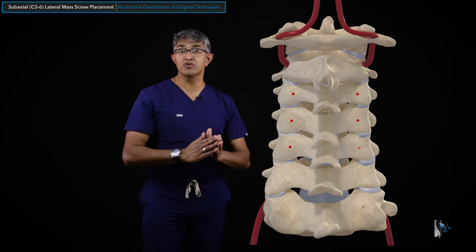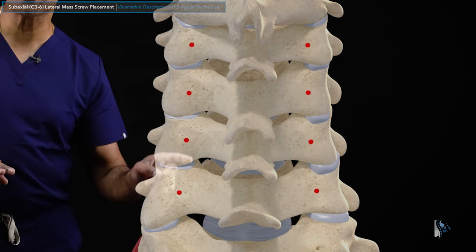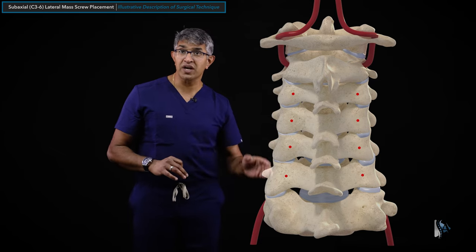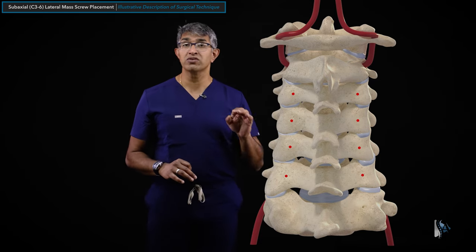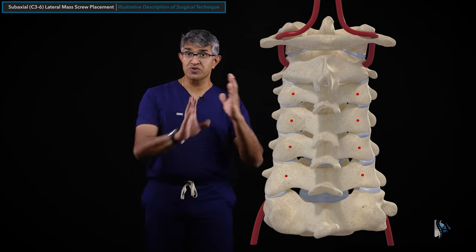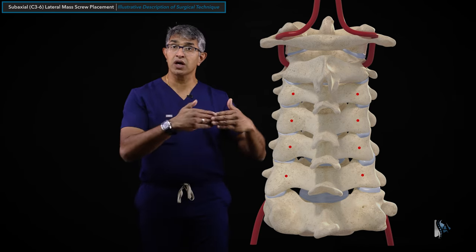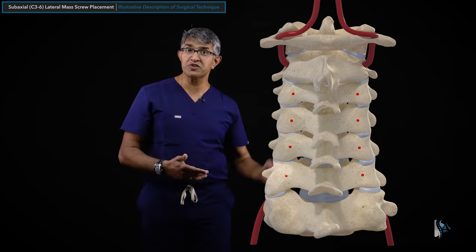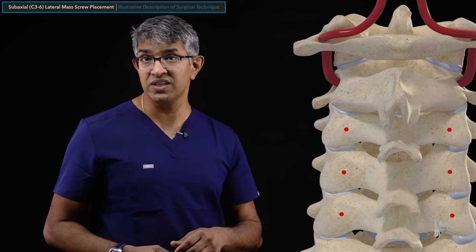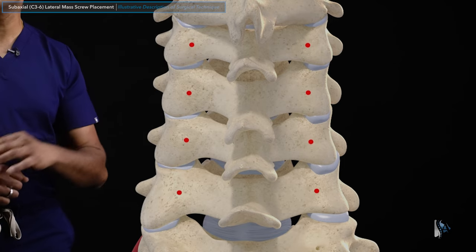If you take the center of those rectangles, you get start points like this. I usually start lateral mass screws right at the center of each lateral mass - the midpoint from top to bottom and from medial to lateral. I pay particular attention to making these start points co-linear so the screws line up properly and the tulips will align, making rod seating easy. I make all start points on both sides before proceeding - a workflow step not everyone does.